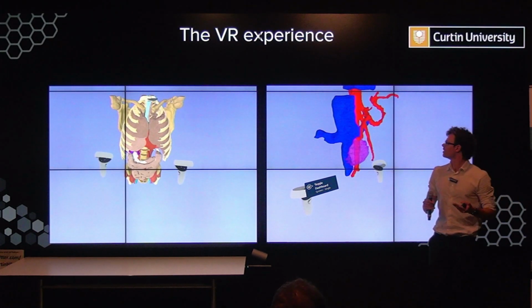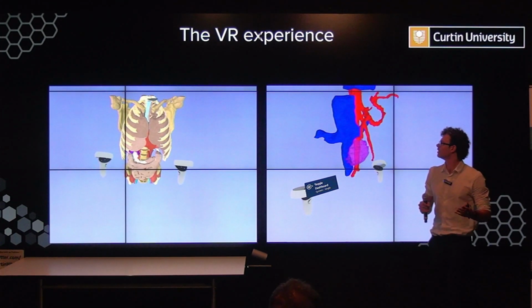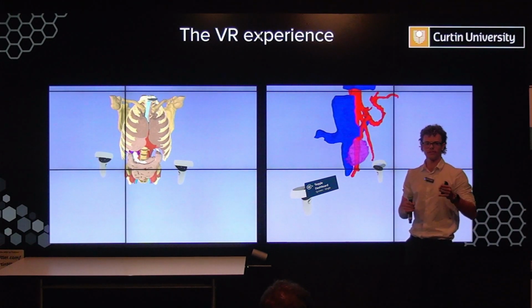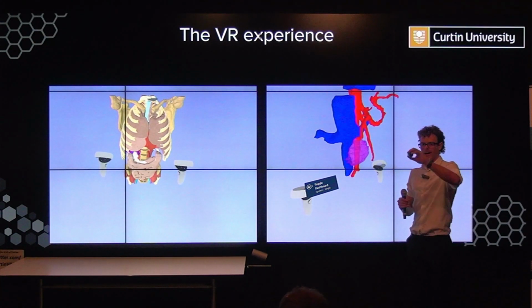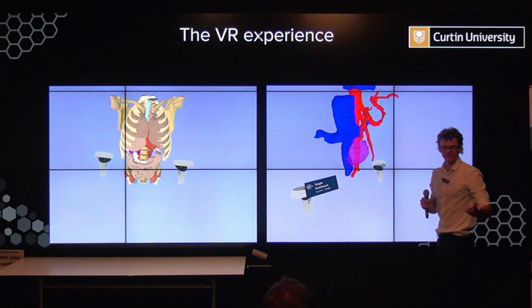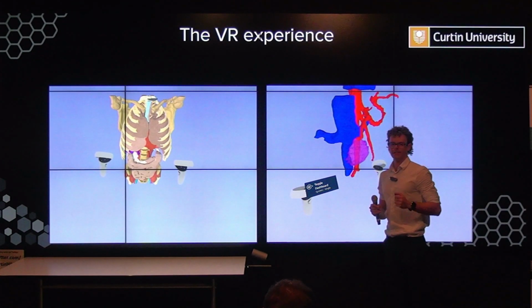Something the surgeons did note yesterday, they really liked when you can mess around and go into the vasculature. So maybe trying a fly through experience with virtual reality. When we're in healthcare talking about fly through, that means going through a structure, if that makes sense. So imagine you've got your artery, it's hollow, and you fly through it. That's what fly through is. It's done a lot in CT colonography.